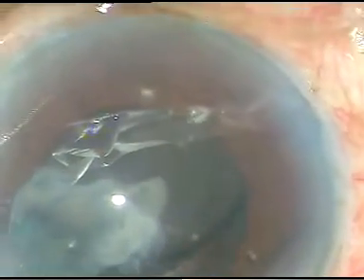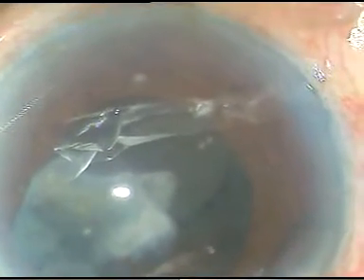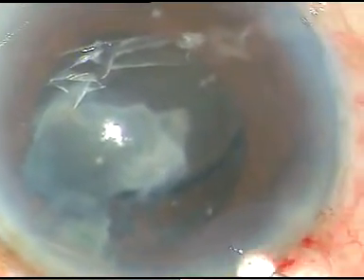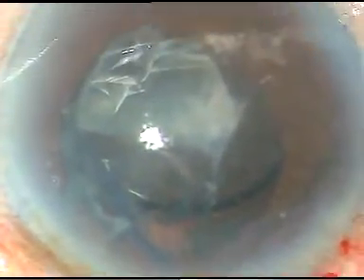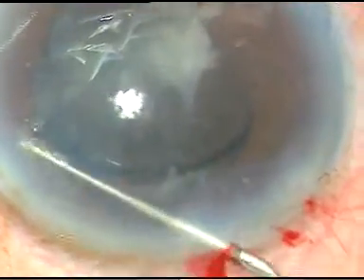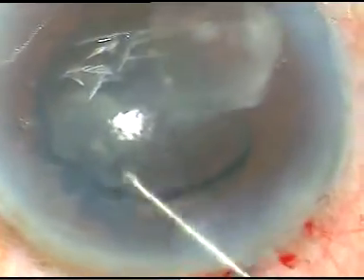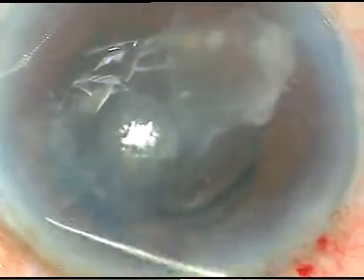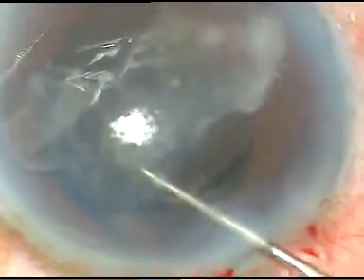And now I have placed both the haptics in the sulcus, and I am very sure about it. The trailing haptic is not yet in the sulcus. The leading haptic has gone into the sulcus in front of the anterior capsular rim. Now this is the trailing haptic. I want to make sure that it goes into the sulcus in front of the anterior capsular rim.